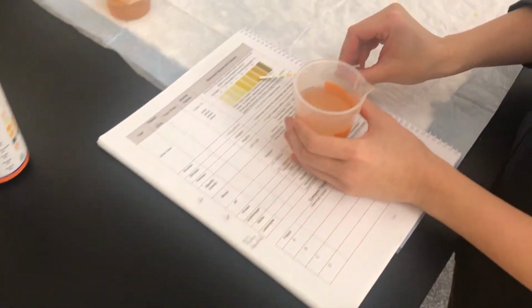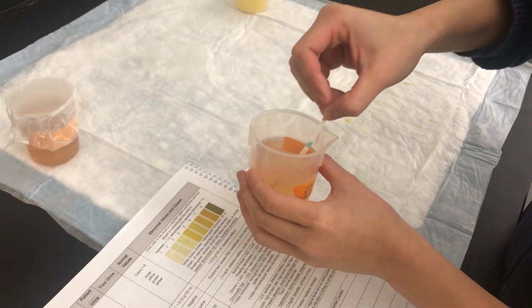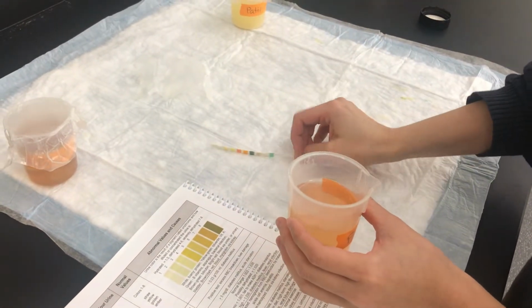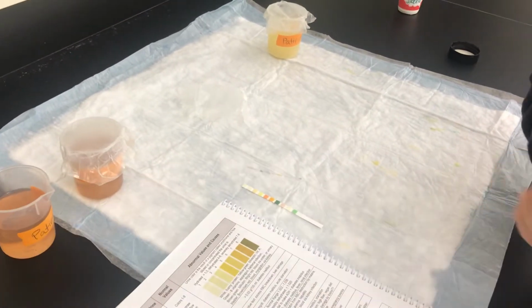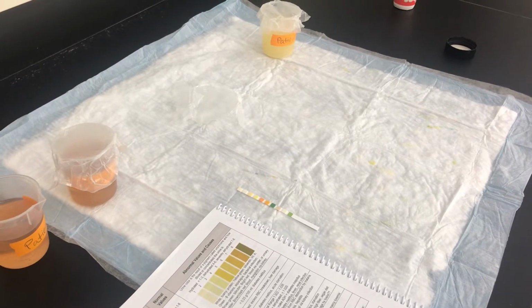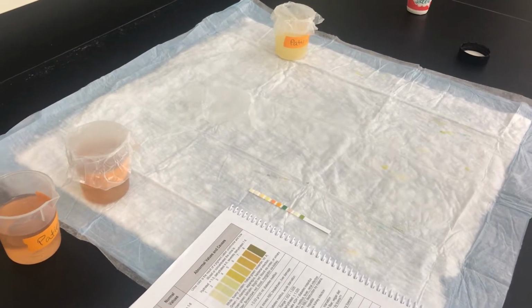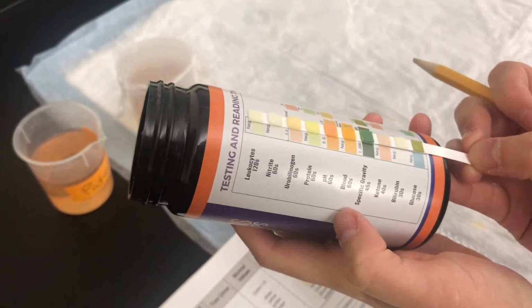And so we're comparing the color of patient B to how hydrated that person is, okay? And then we're going to take our dipstick and just dip it in until we hit the very last square, and then let it develop for a while, okay? So it'll take a little bit of time to develop. Okay, and then the way you read this, once it's done, is you start from the very bottom and you start moving to the top.